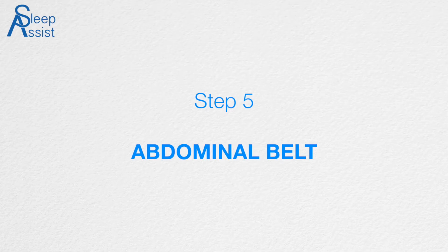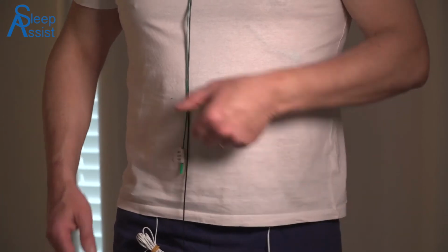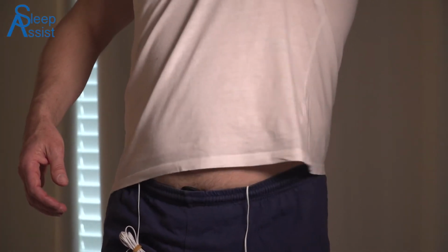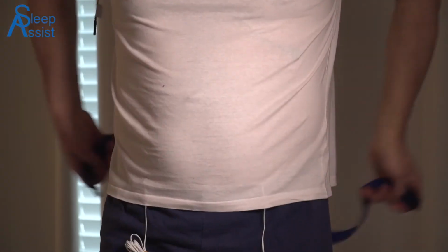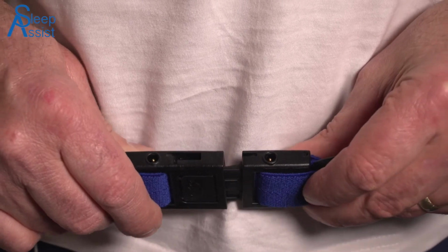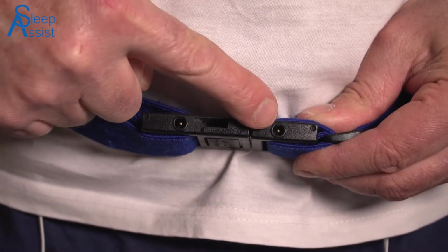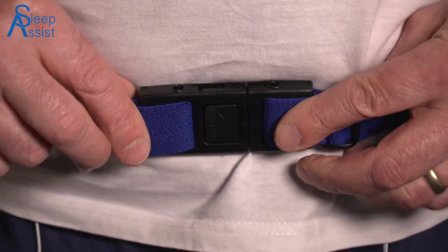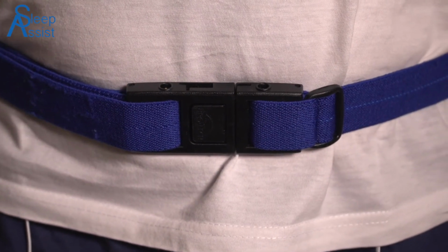Step 5. Abdominal belt. Carefully move the 2 chest leads over your shoulder so they do not get caught underneath the elasticized belts. Place abdominal belt around your waist. The belt will have already been personally fitted to you, so no further adjustments should be required. Ensure both female ports located in the clips are facing upwards.